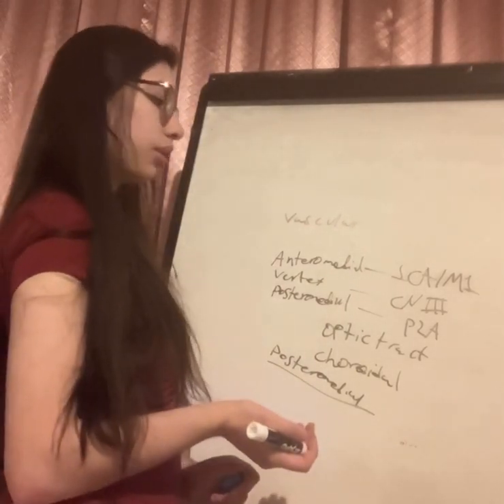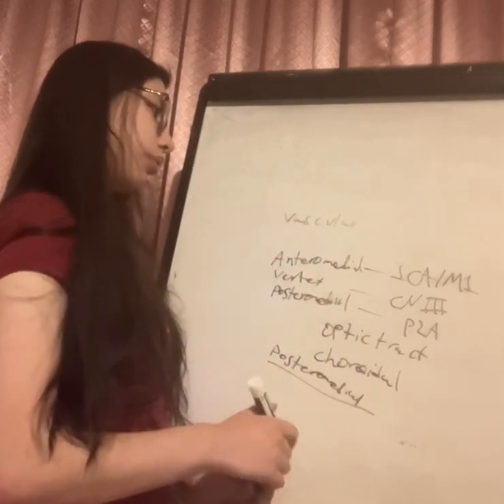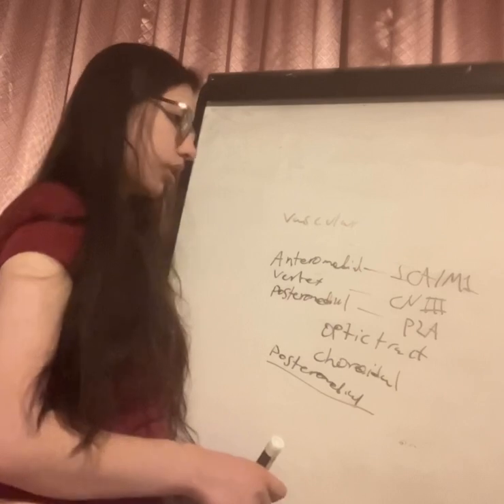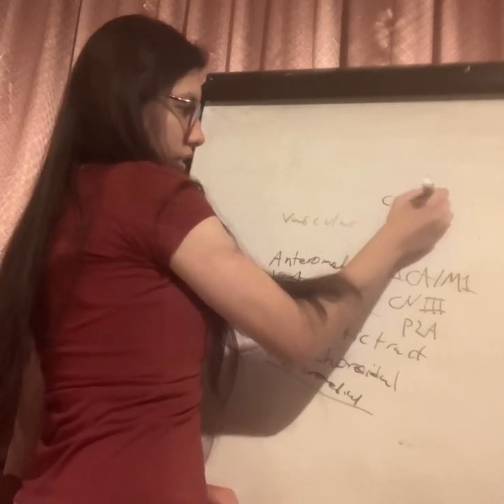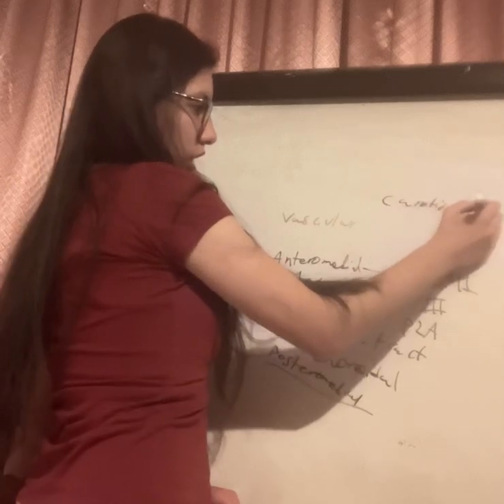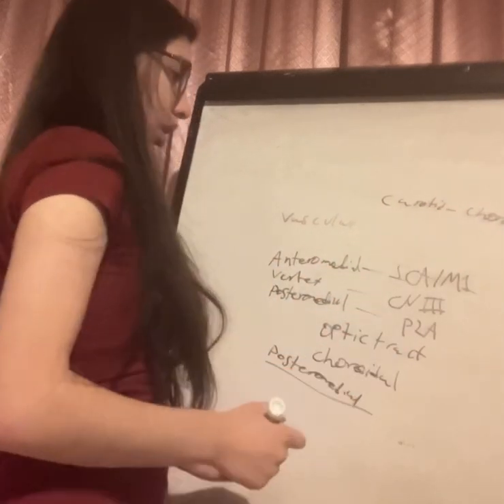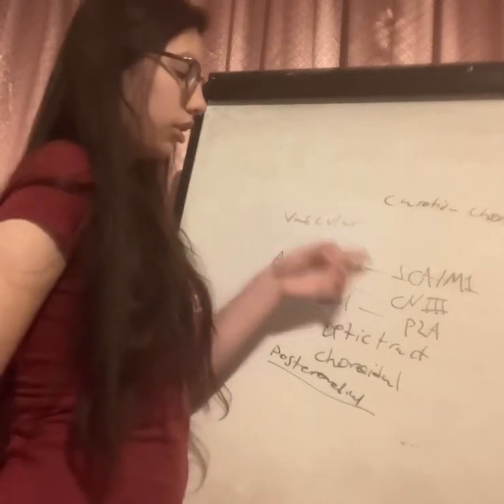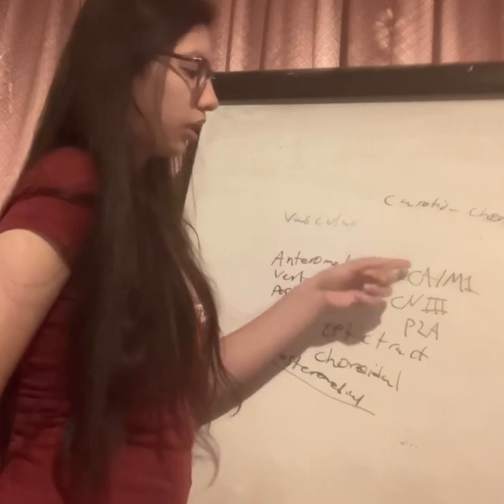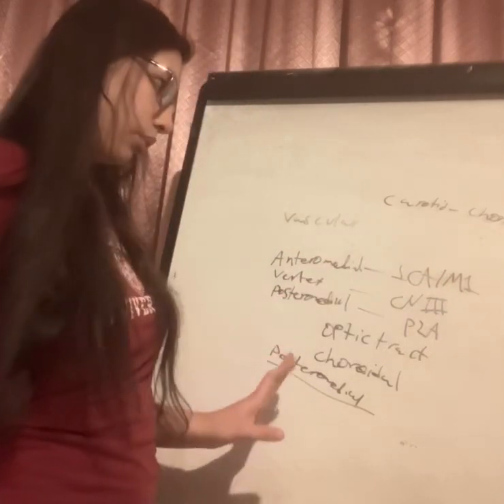Now, something that we can do to approach the superior border of the resection is to trace the carotid-choroidal line. The carotid-choroidal line is a line that goes from either the bifurcation of the internal carotid artery or the M1 segment to the inferior choroidal point.